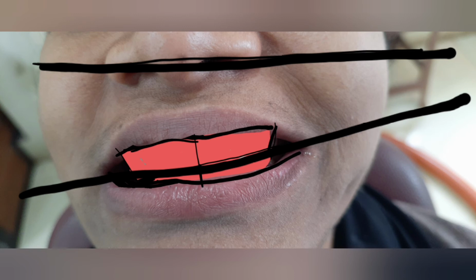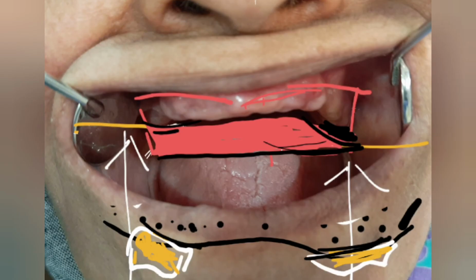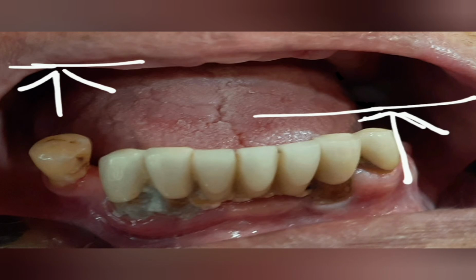The dental chair may be an obstruction, but try to view directly from the front. Once the horizontal reference plane is set, check the amount of ridge discrepancy. This should have been done during the diagnosis and treatment planning period, but most often we tend to skip the fine observation. Surgical correction was an option, but in cases of severe sinus drop, we need to drop the idea.